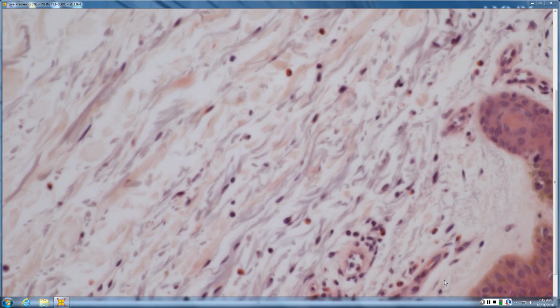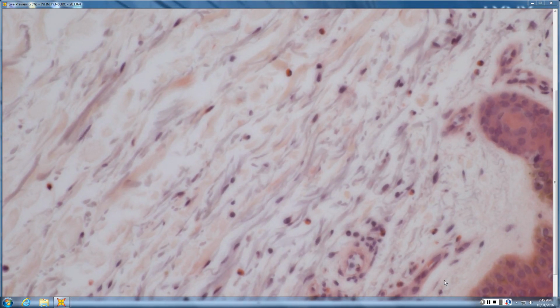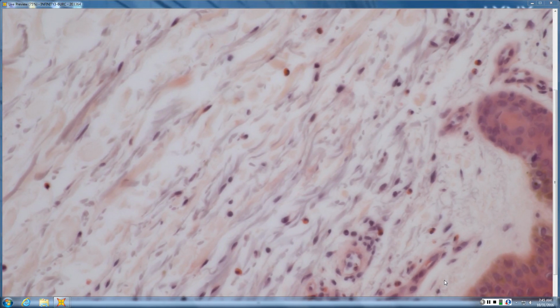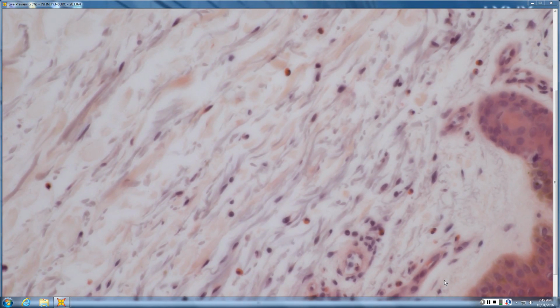Yeah. So the main difference at scan between early vasculitis and urticaria, both are neutrophilic processes. In leukocytoclastic vasculitis, you have, shockingly, leukocytoclasia. Right? So if you have no karyorrhexis, it is not vasculitis. Whereas in urticaria, it's very rare to see any karyorrhexis.